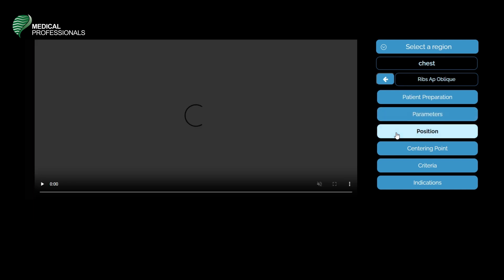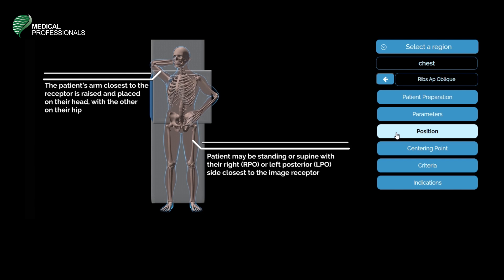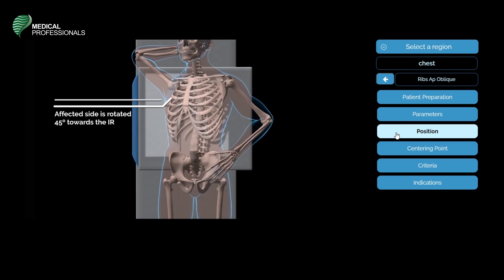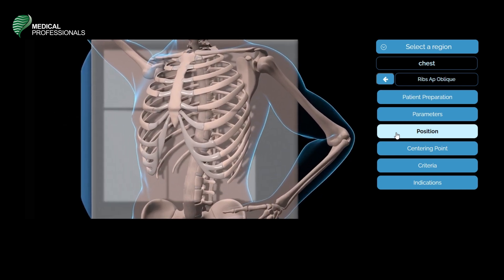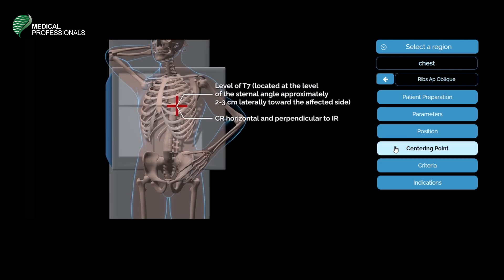The patient's position in an oblique AP of the ribs: the arm closest to the receptor should be raised and placed on the head, with the other on the hip. The patient may be standing or supine with their right RPO or left LPO side closest to the image receptor. The central ray will be horizontal and perpendicular to the image receptor, centered at the level of T7 at the level of the sternal angle, approximately 2 to 3 centimeters laterally toward the affected side.